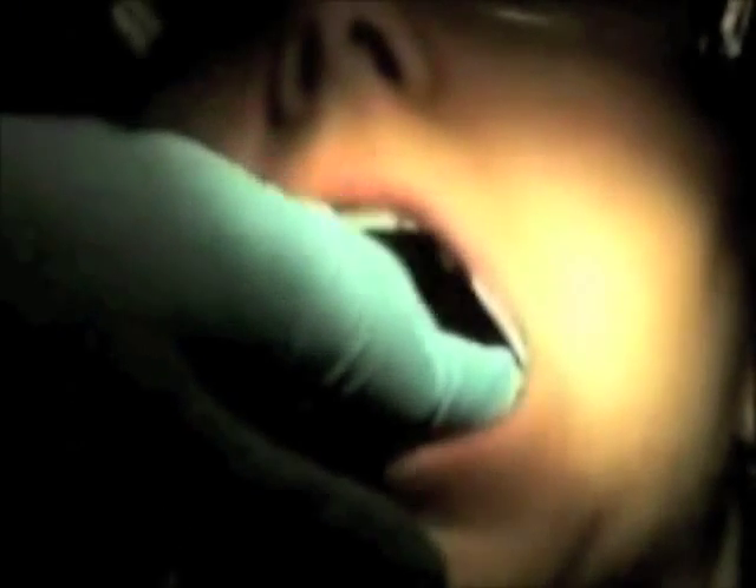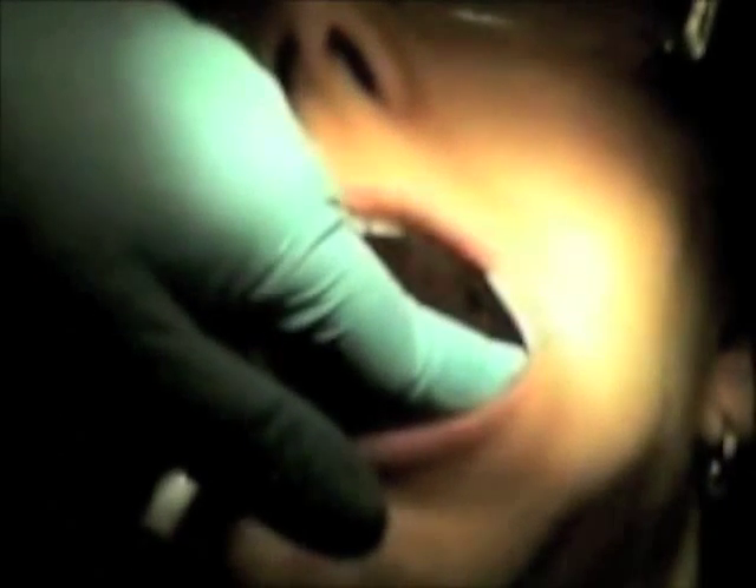The teeth will be dried in a zigzag motion, buccal to lingual. The fluoride is continuously applied for the recommended amount of time, then the cotton rolls are removed.